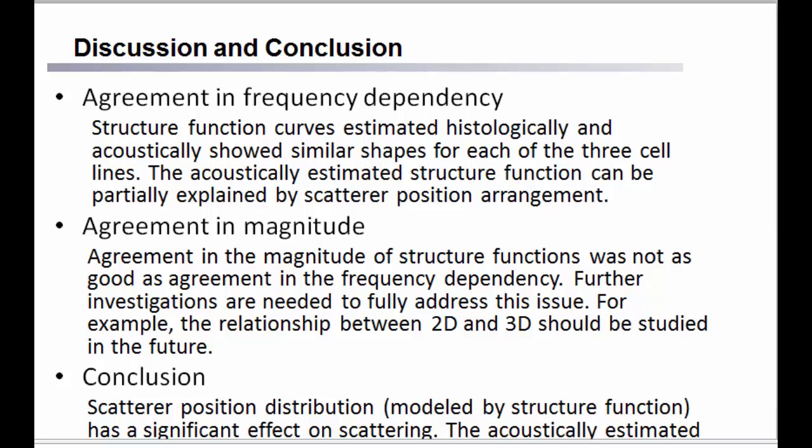From the result, we see the scatterer position distribution has a significant effect on scattering, and the acoustically estimated structure function is related to histology and can yield useful information on tissue microstructure.